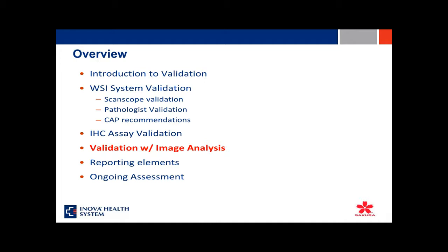So when we're talking about calibration, we're talking about the color and the intensity of the light and the software settings and so on and so forth. And we need to have documentation that the calibration settings yield correct test results, and also these have to be calibrated periodically, every 6 months, or whenever there is a major maintenance for your equipment, or whenever you're using a new reagent lot, or whenever the manufacturer recommends it.